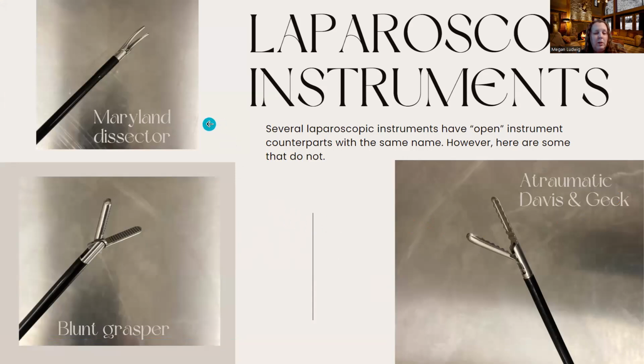We don't typically, at least not to my knowledge, have an open version of a Maryland. There's something that looks similar. I mean, it looks very similar to maybe what a hemostat or a Kelly might look like, but we call it a Maryland dissector. So yes, you can grasp with it. It's got that nice grasping serrations to it, I guess you could say, but it's also really good for putting those little teeth, not teeth really, but the ends inside a tight space.